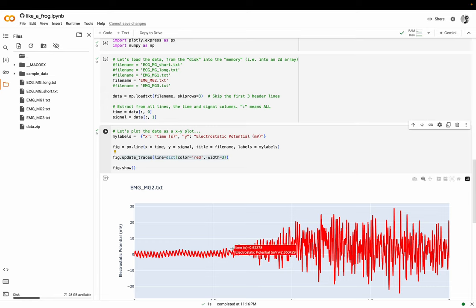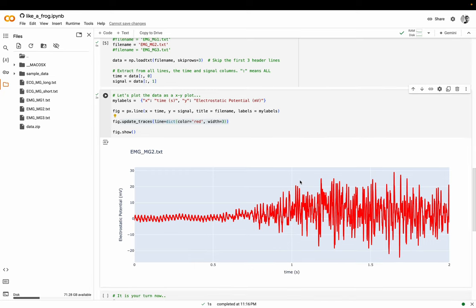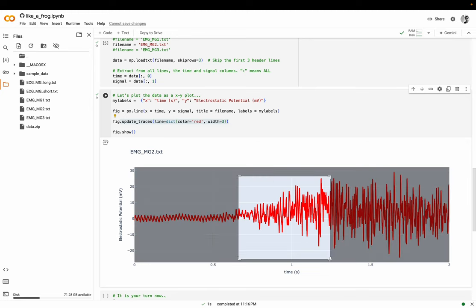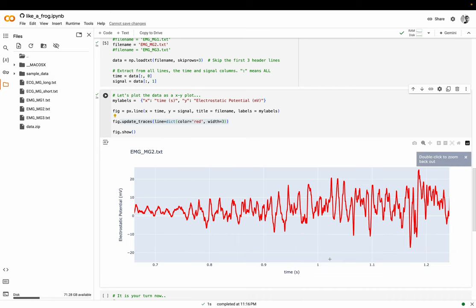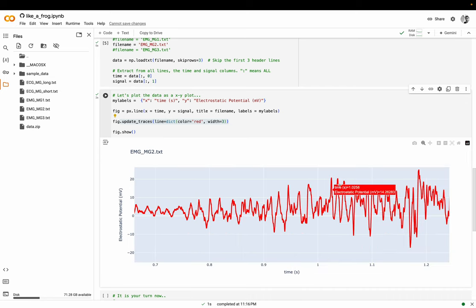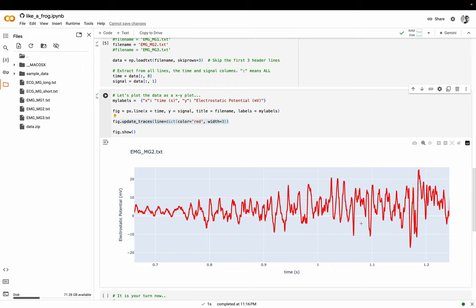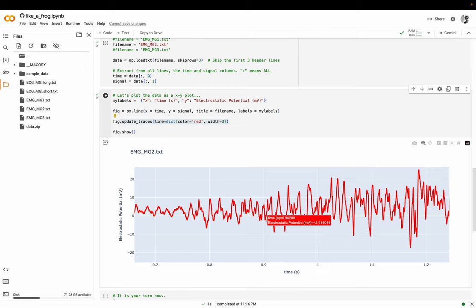This is when I was at some point contracting my muscles. The electrodes were on my arm, they were not anymore on my chest. You see here that the variance of the signal seems to change. Of course now it's not working, but this library should allow you to do zooming in. It's probably slow because I'm recording. You see there are some sort of synchronized waves that are related to my muscles. Because here you have time in seconds, you could probably see how fast these waves are happening.